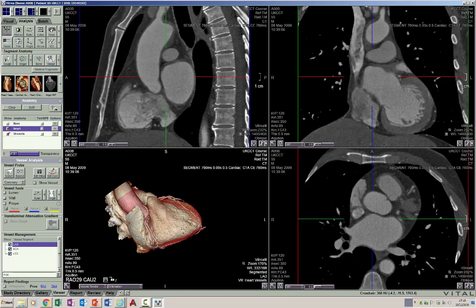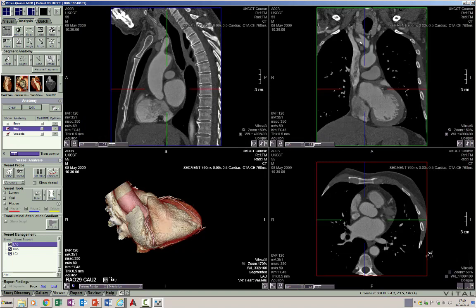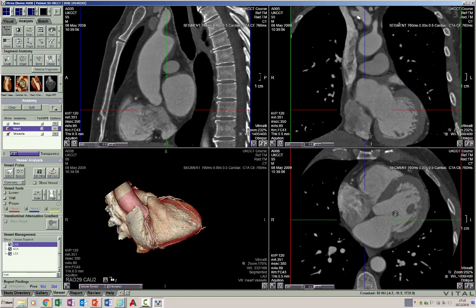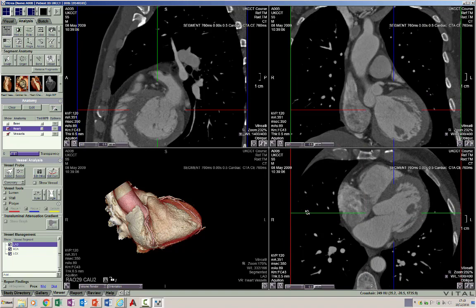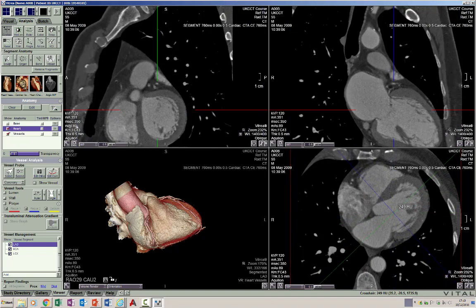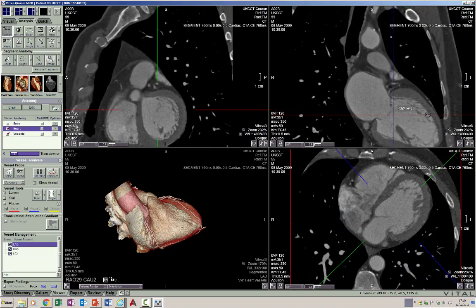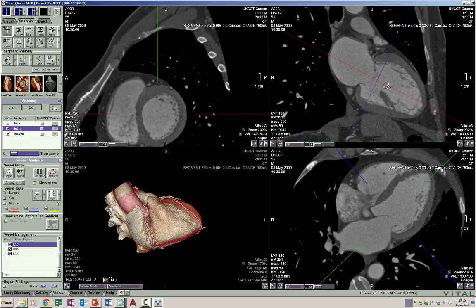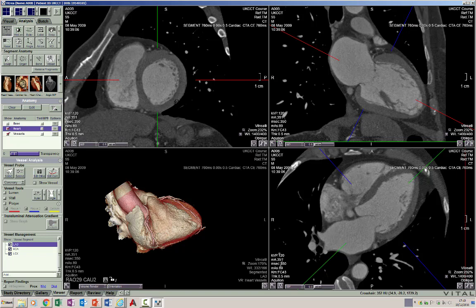Let's go back to the short and long axis images and understand the segmentation of the left ventricle. There is a standard international 17-segment model for naming different parts of the left ventricular myocardium.